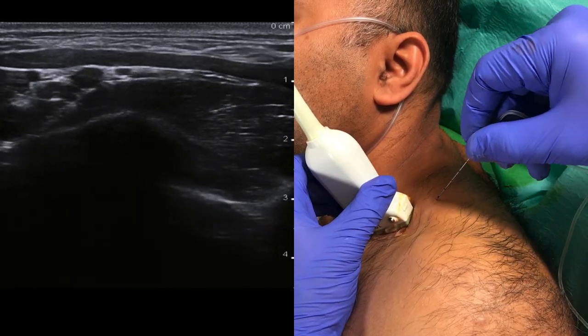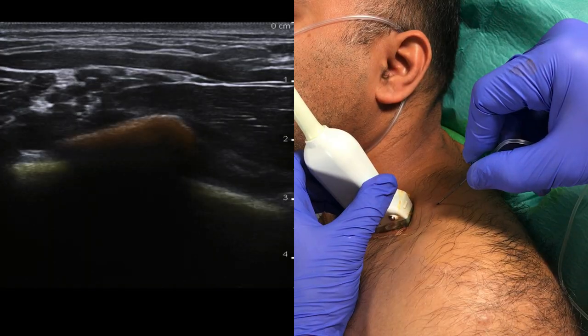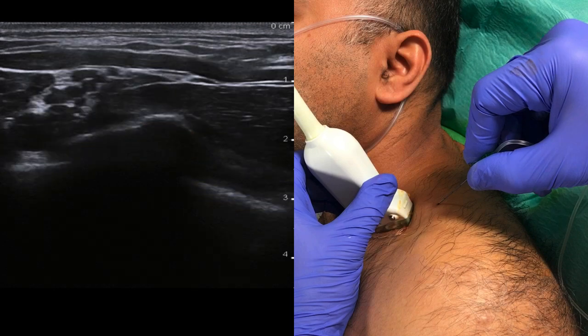When approaching the nerves, take care to identify the following structures. The pleural line, which we've here marked in yellow, should be avoided at all times. The orange structure is the first rib, which can often be removed from the picture by a slight rotation of the rear end of the probe. This allows for an easier access to the brachial plexus.